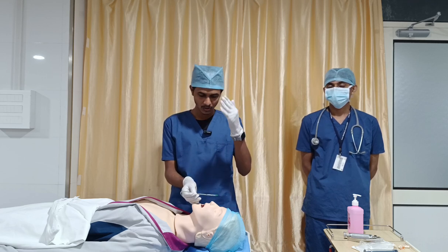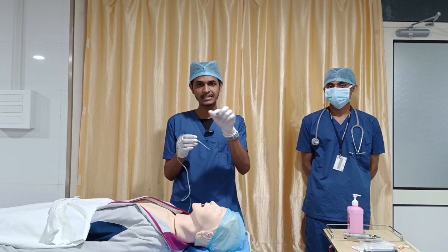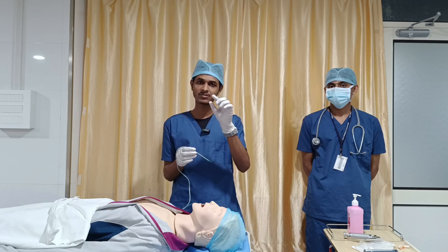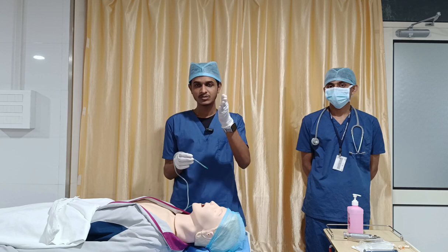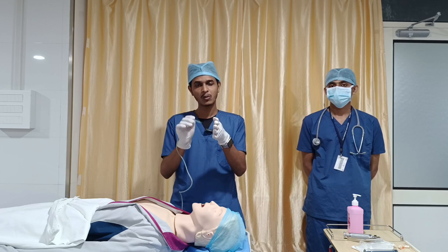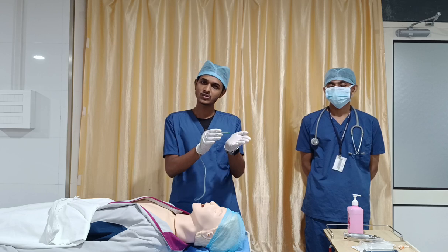If the septum is deviated to the right side, the outer nostril diameter on the right side will be large, but if you are getting into the distal region, the diameter of the distal portion will be less. So if it is deviated to the right side, the outer region will have a large diameter and the distal region a smaller diameter. So ideally we have to choose the left nostril based on that deviation. Whichever side is deviated, we have to choose the opposite side.